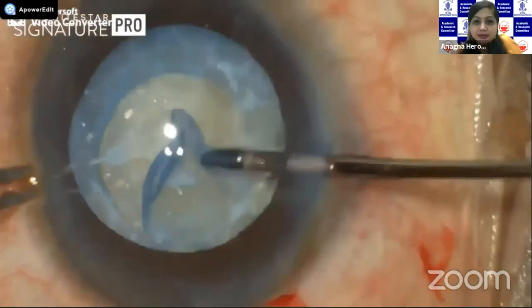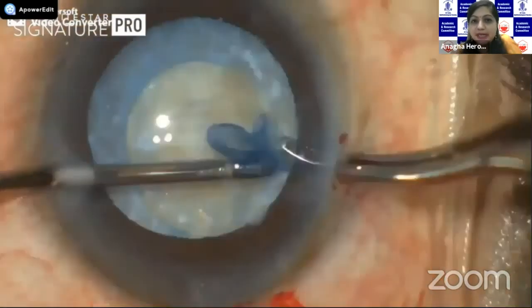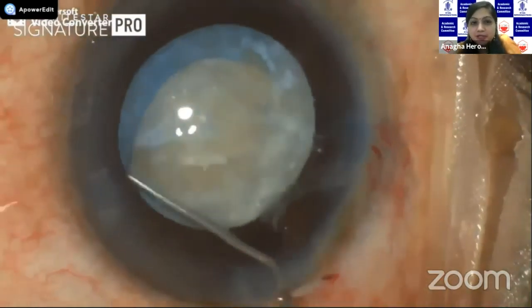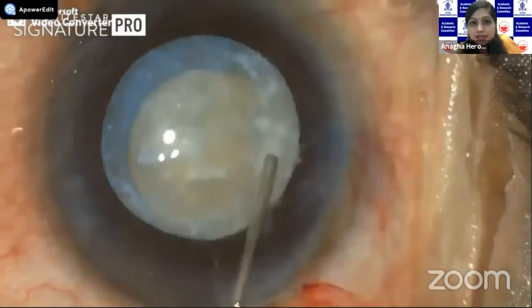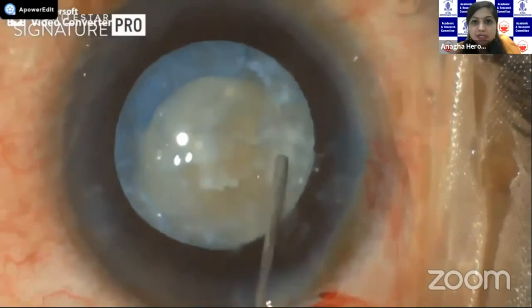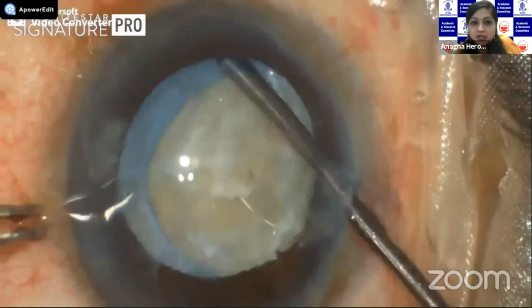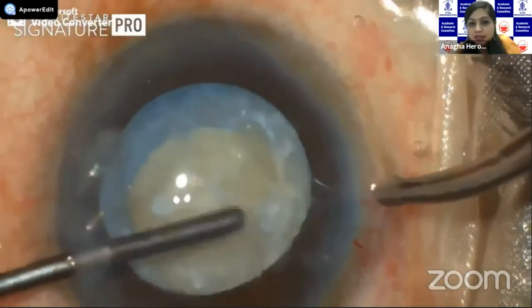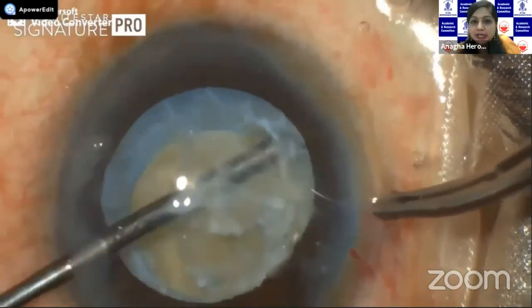Here you can see the capsule is very adherent to the underlying subcapsular tissues and we have to literally peel it off from all sides with micro forceps. After this is done, when we attempted the hydrodissection, you can see the peripheral anterior capsular rim is also adherent. We are trying to gently do a blunt dissection with a spatula. From one side we were able to complete it, and as we went to the other side, we could see there was a very thick subcapsular fibrotic plaque.